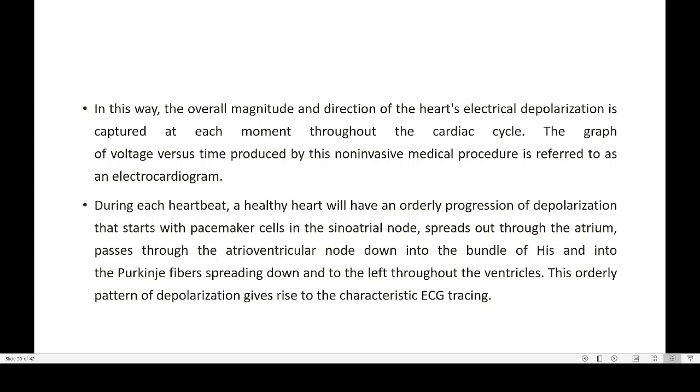Non-invasive means if we are injecting a syringe into your body, it is an invasive method. If you are putting some endoscope into your body, it is an invasive method. Here we are not introducing anything inside your body. We are just using some scanning. It's a non-invasive method, because without entering your body, without putting anything inside your body, the doctor is getting an idea of different organs in your body. Such techniques are known as non-invasive methods.